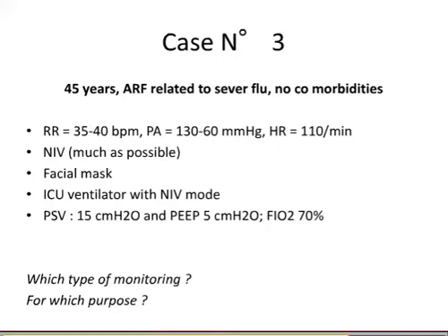If we're using an ICU ventilator, why don't we turn the dynamic loop on? Because if we want to stay with NIV, then we can at least see how high we can go, we can see the effort, we can see the compliance of the system, and we can see if any leaks develop, because then the loop would come off the screen. It's so simple to do. And if we can't give the patient what he needs, then he needs intubation. But it's there, so why not turn it on? Okay, okay.